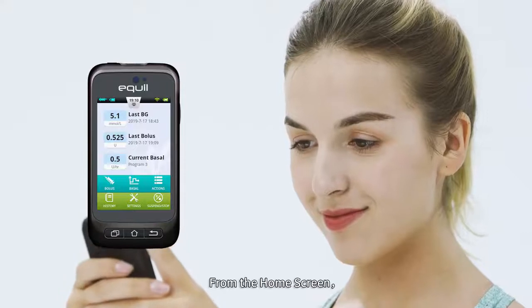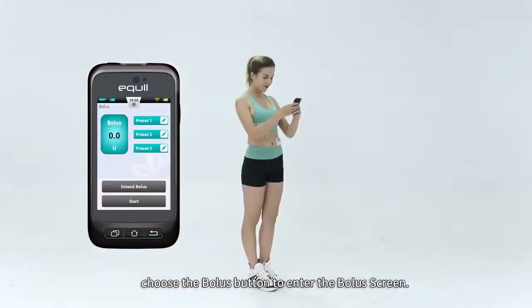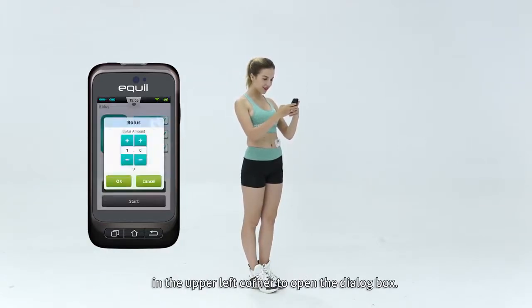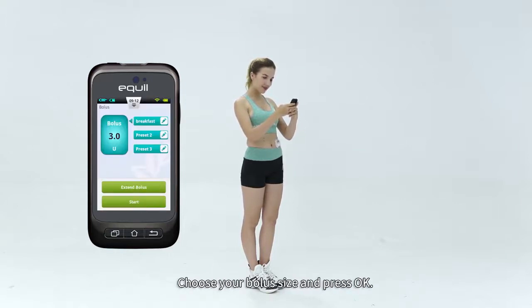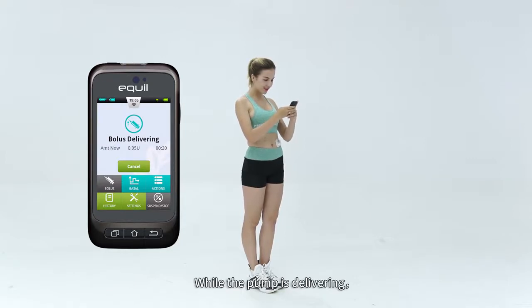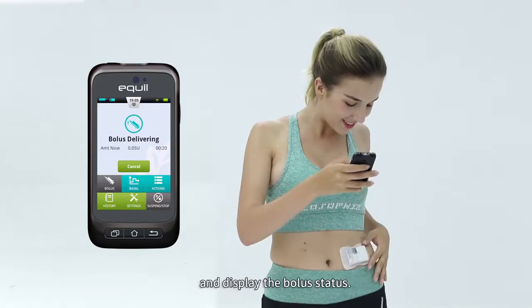4. Bolus. 1. Manual boluses. From the home screen, choose the Bolus button to enter the bolus screen. Choose the Bolus button in the upper left corner to open the dialog box. Choose your bolus size and press OK. While the pump is delivering, the PDA will revert to the home screen and display the bolus status.